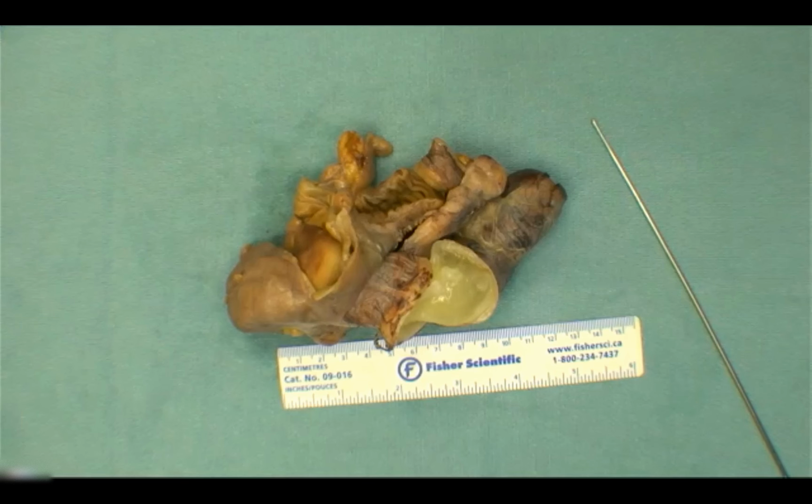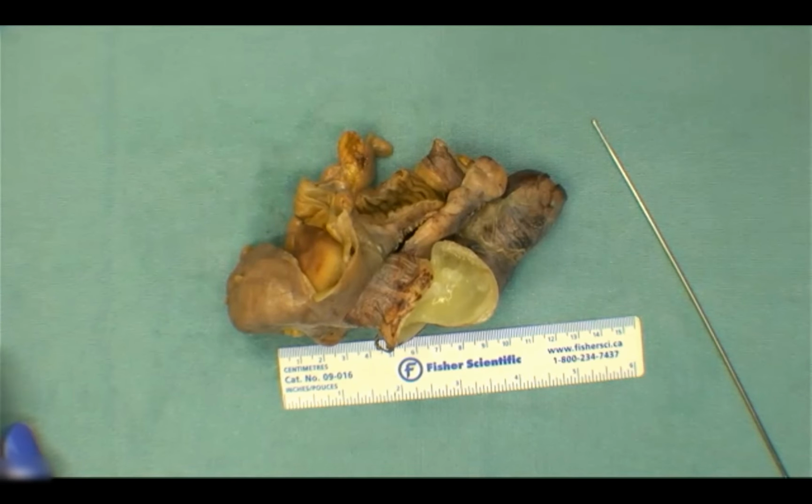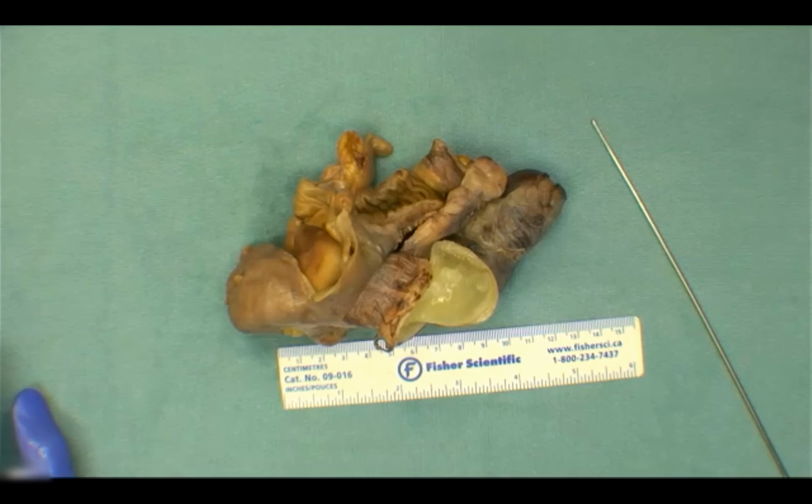Okay, so we've got quite a spread here. Nothing is 100%, of course, but I think we can all agree on that probably a mucinous neoplasm. So when you think about overproduction, it's either going to be an overproduction of mucin or some kind of obstruction that prevents the mucin from being excreted normally, right? Because mucin is always produced by any of the colonic epithelial lining cells. It's just a matter of whether it's too much or not fast enough to get rid of it.